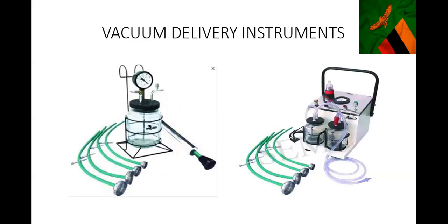These are your vacuum delivery instruments. You have a manual vacuum delivery instrument on the left side, but if you go to a labor ward like UTH, you'll find an electrical one like the one on the right. This is a vacuum delivery machine or instrument.